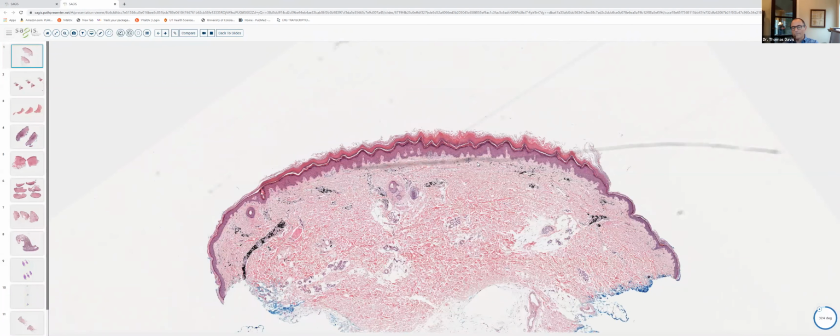So what we've got here is a biopsy site. A previous biopsy was done here. We've got some fibrosis or fibrosing granulation tissue, and the dermis is going to give rise to a very superficial scar. And this material in the histiocytes in the underlying dermis is aluminum chloride or Drysol, which was used as a hemostatic agent. And the calcification in the dermis is a frequent accompaniment to an aluminum chloride reaction.